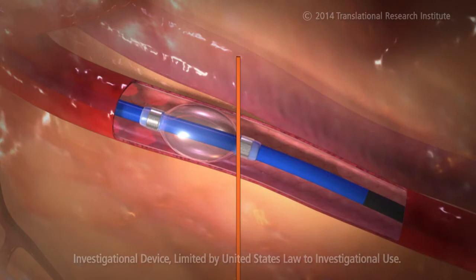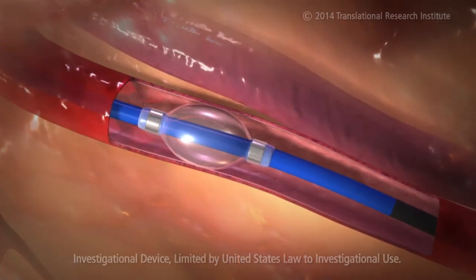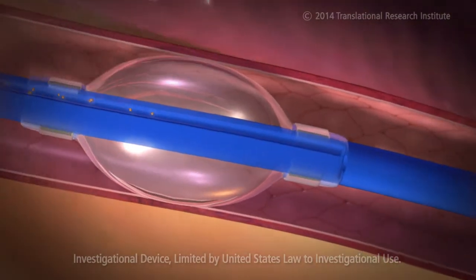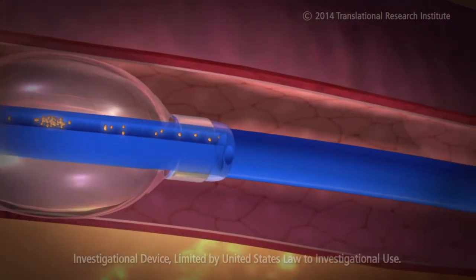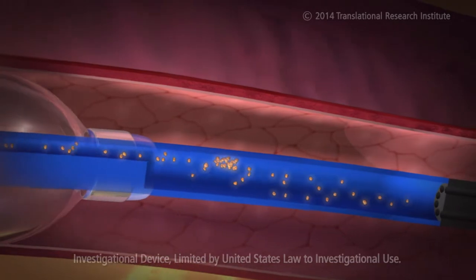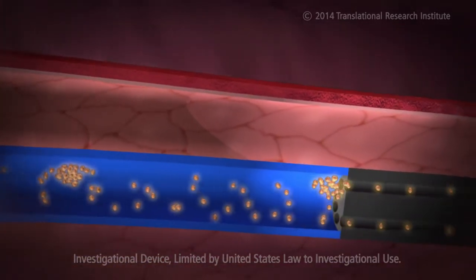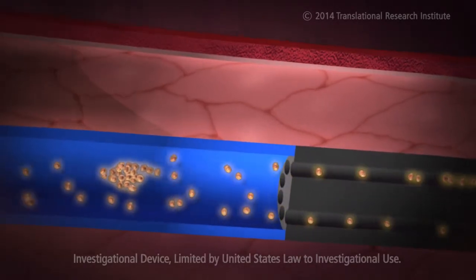The balloon controls blood flow, helping to localize stem cells into the targeted area during infusion. Stem cells are introduced into the catheter and move through the system towards the catheter tip. The expansion chamber regulates the flow velocity before the cells enter the multiple lumens.